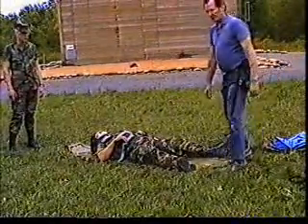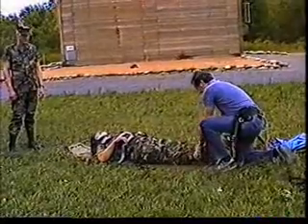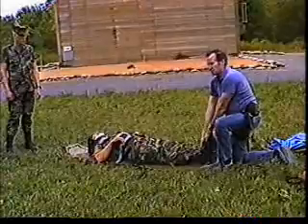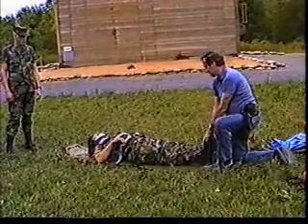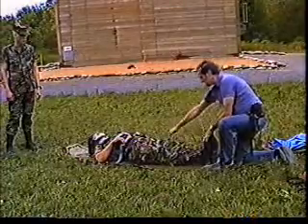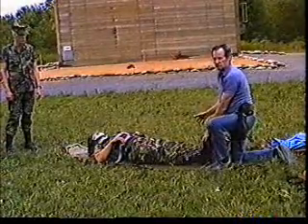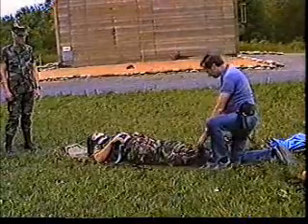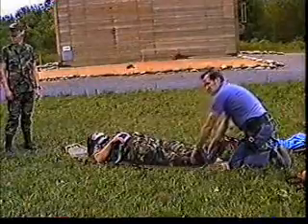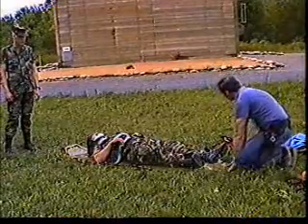Now if there was a spinal injury, at this time what I would do, bring the feet together and I'd tie them together. Okay, we want to make sure that there's no movement of that spine. And then we would, after we get the stretcher, or even before, we put some padding in here when we close the stretcher. That effectively makes the stretcher into a longboard. So if there is no spinal injury, we can leave the feet splayed and they'd stick out the end when we're done, okay?